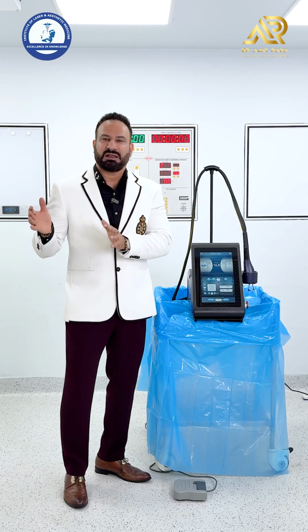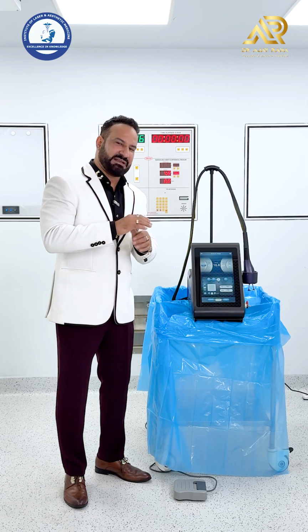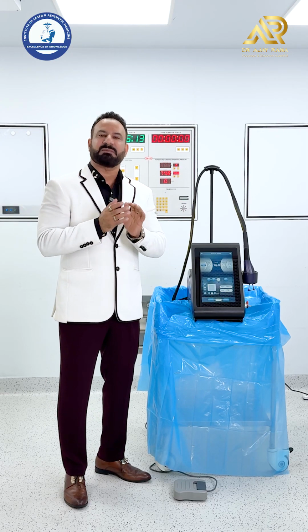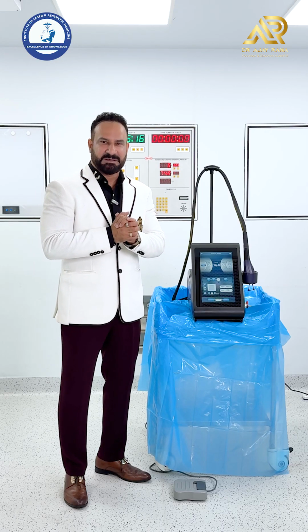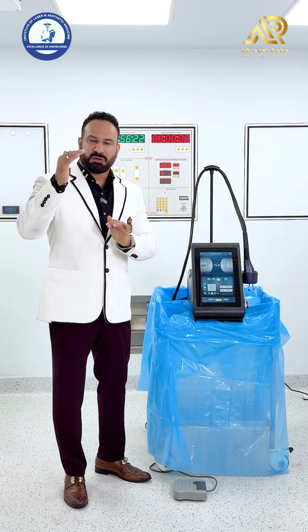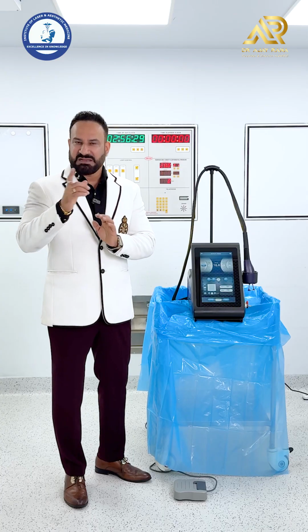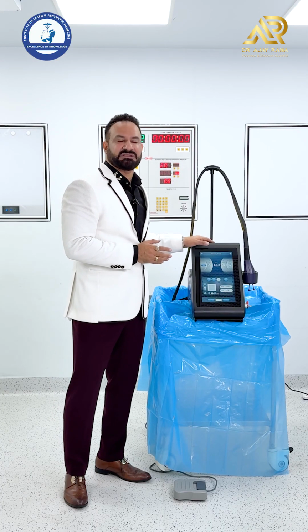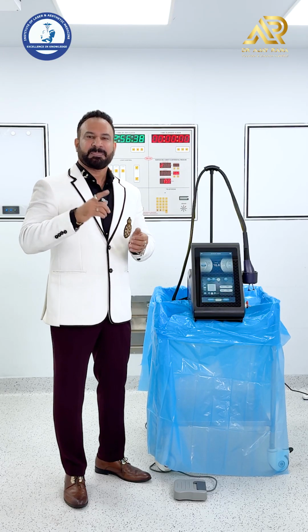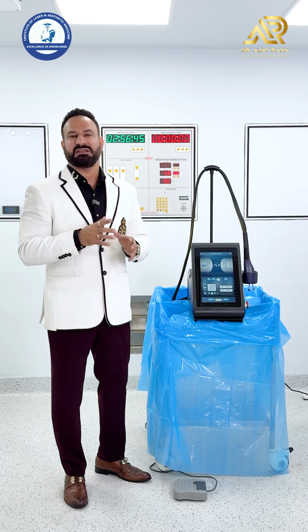If you go towards the non-ablative side, meaning the platforms which do not burn the skin, without burning the top layers they enter the skin layers. There you have the thulium laser, 1927 nanometers, and erbium glass, 1550 or 1560 nanometers. This particular platform is a little higher in terms of water absorption. It is much stronger than erbium glass, but less ablative than carbon dioxide, making it a versatile tool for treating skins of color. Because the major problem when you treat skins of color is that you end up having downtime as well as higher chances of developing post-inflammatory hyperpigmentation.